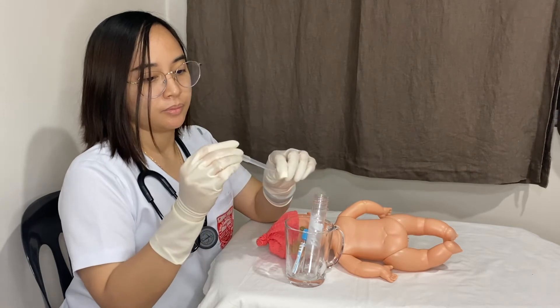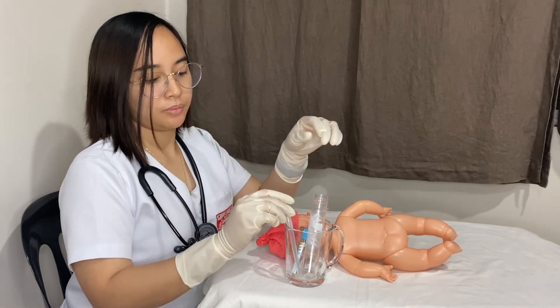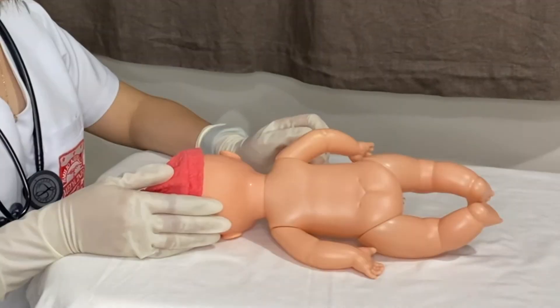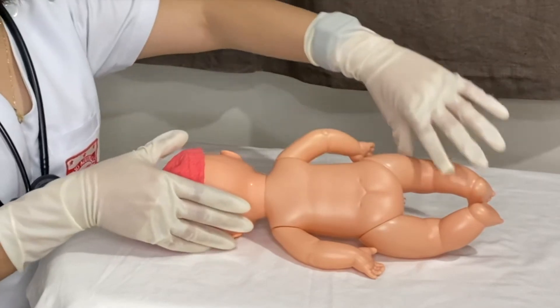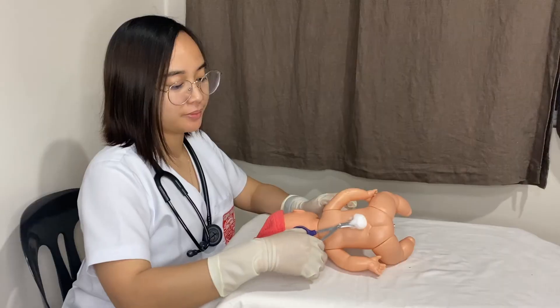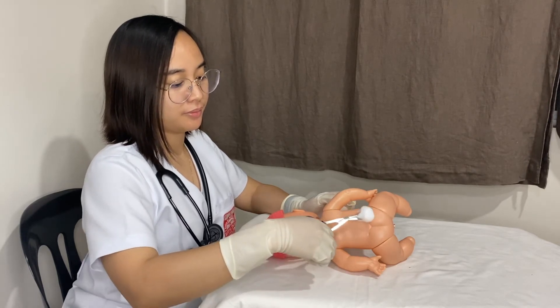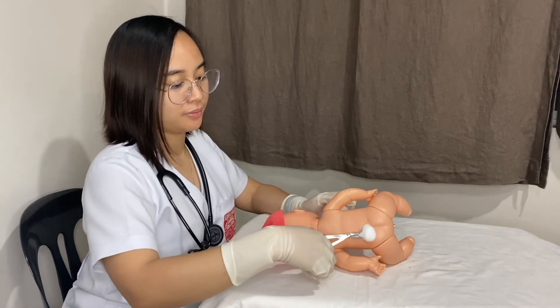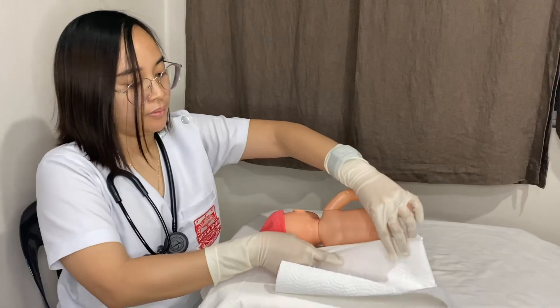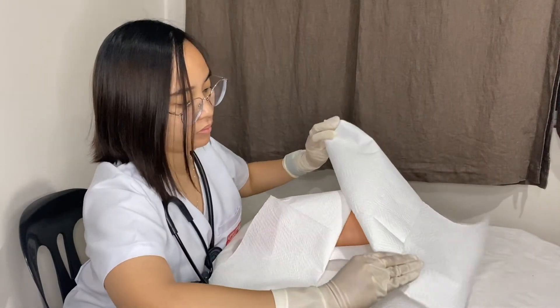For infants, use a 22-gauge 1.5-inch needle. For older children and adolescents, use longer or larger gauge needles. The helper will hold the hips and shoulders, curling the child in a position to open up the interspinous processes. Clean the site in a circular motion working from the inside out. Clean beyond the area where you will drape with chlorhexidine and betadine. Place your drape so as to create an opening through which everything is sterile.